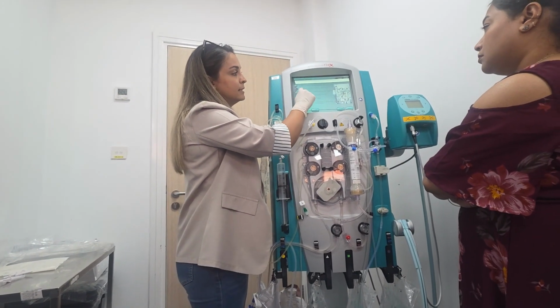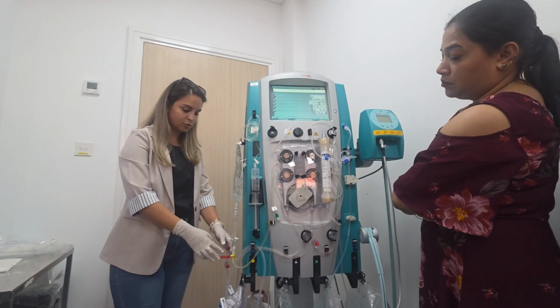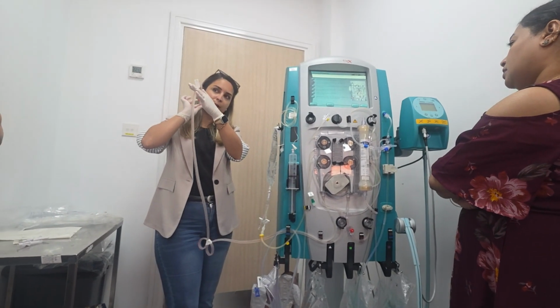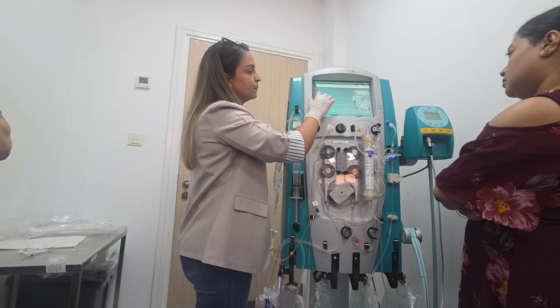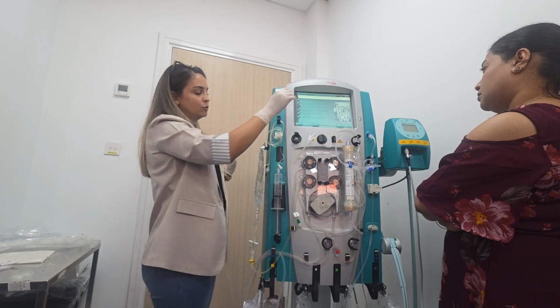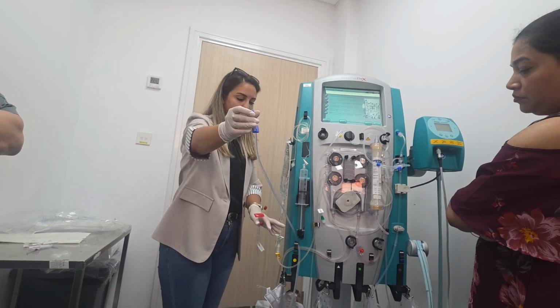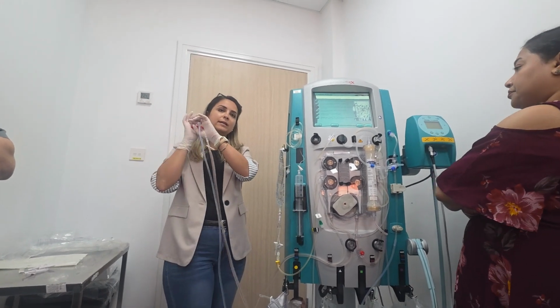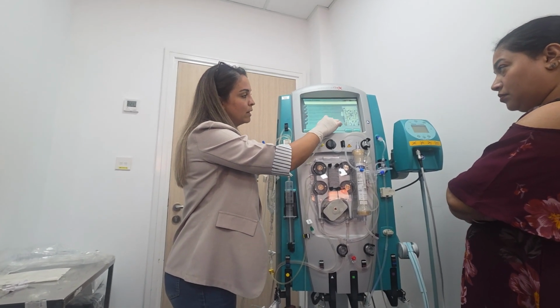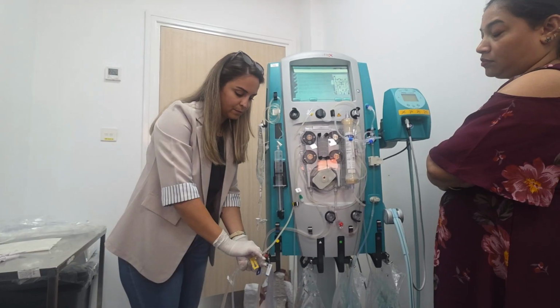Next, disconnect the access line from the Y line and connect to the red lumen of the catheter. So the access you will disconnect and connect to the patient. Okay? Now the blue, disconnect the return line from the collection effluent bag and connect it to the blue line of the patient. So disconnect the blue and connect it to the patient catheter. Next, disconnect effluent from the Y line and connect it to the effluent bag. So effluent line to the effluent bag.